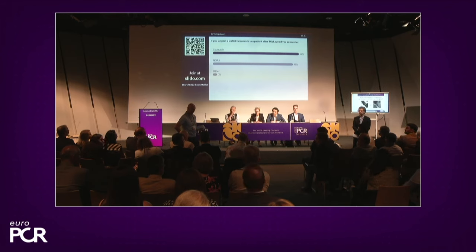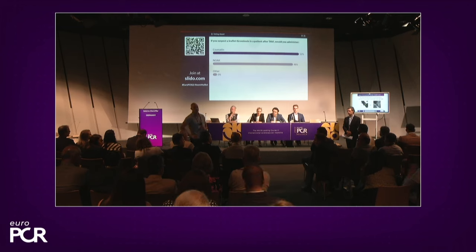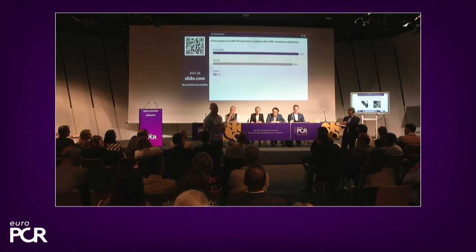I mean, we're all dealing with it. We're all not doing CT routinely after. But we should try and follow the patients as much as we can, because what we invest in TAVI these days, and it's not just in Israel or in Germany, but in the entire world, is something that we have not seen previously in cardiology. So we should put any effort we can into clinical follow-up and so-called cheap imaging in order to find this as soon as possible and then do what we need.